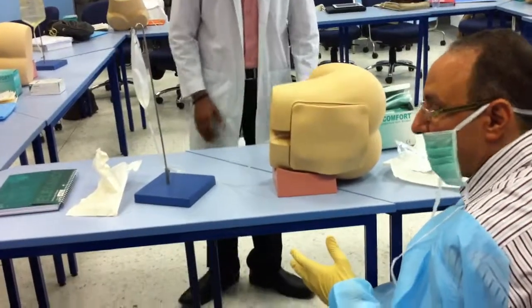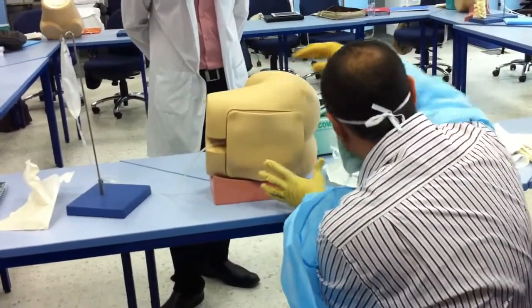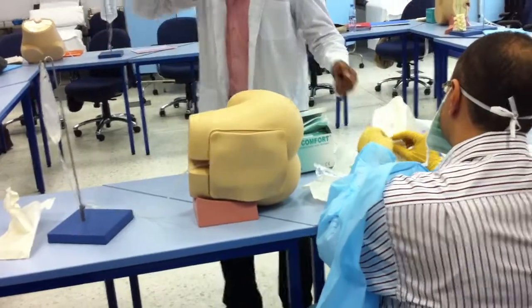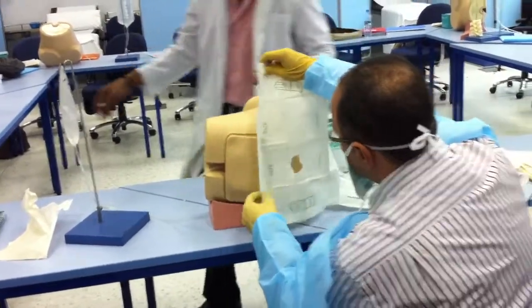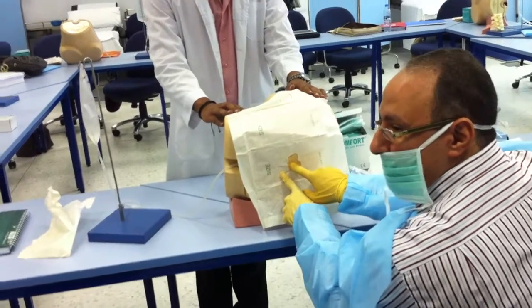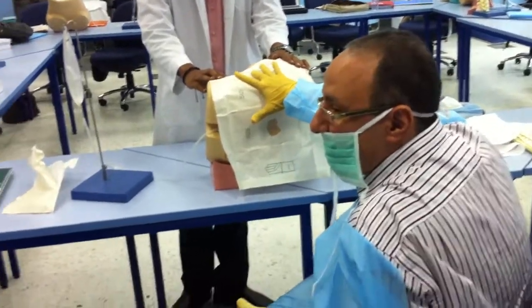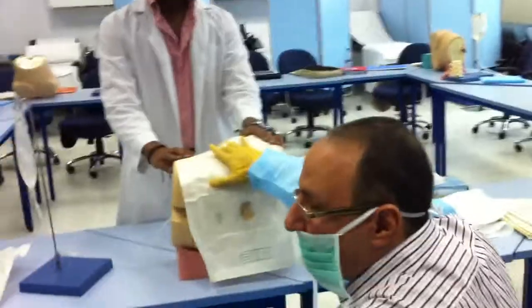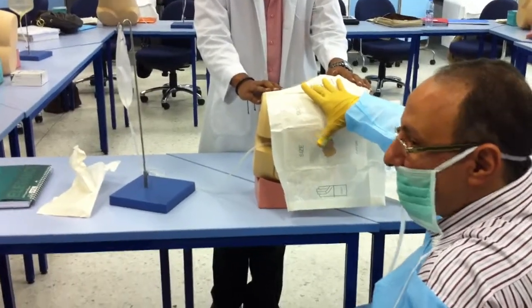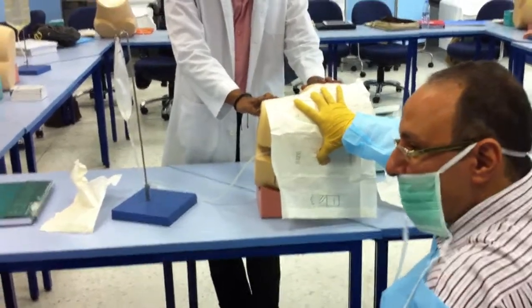Then I place the drapes. The drape is usually one piece with a circle in the middle, placed so the circle faces the space I'm going to enter. This drape is important because I need to touch the iliac crest — if this area is not sterilized, I have lost my sterility. The drape allows my thumb to touch the space freely without contamination.